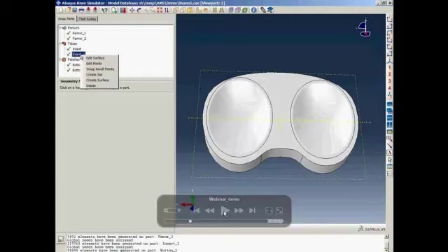And also, they can create sets and surfaces for output here. So if the user chooses to create sets and surfaces in the knee parts tab, those sets and surfaces are automatically generated for all the workflows. Later on, you will find that in each workflow, the user can also create surfaces or sets, but in that case, all the surfaces and sets will be available only for that workflow.